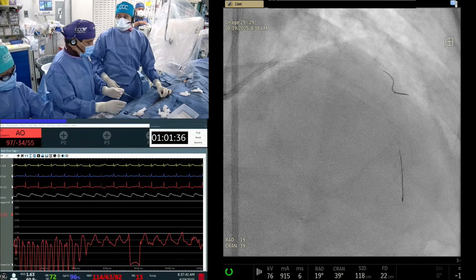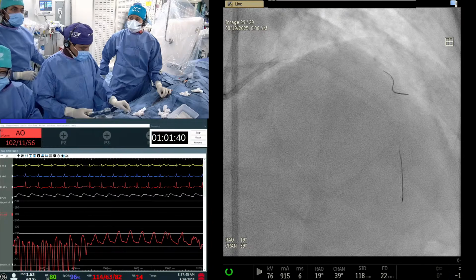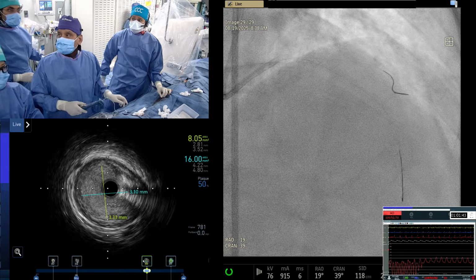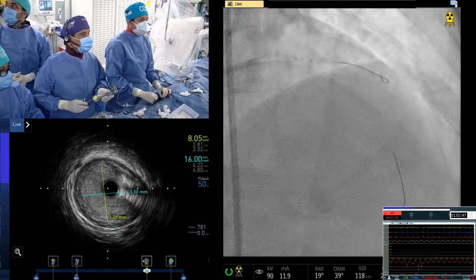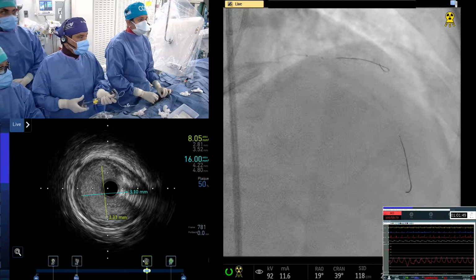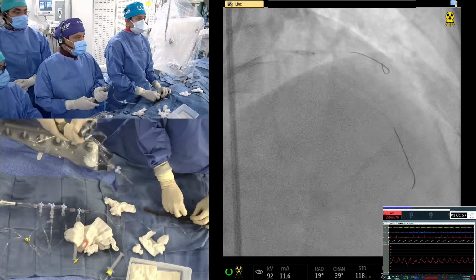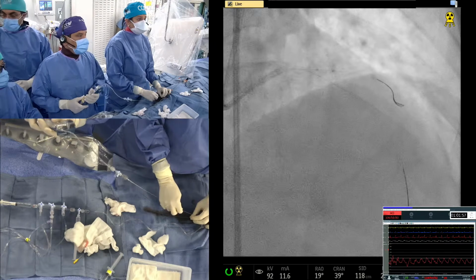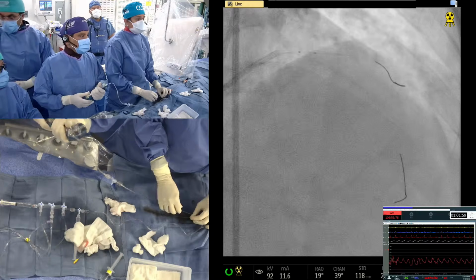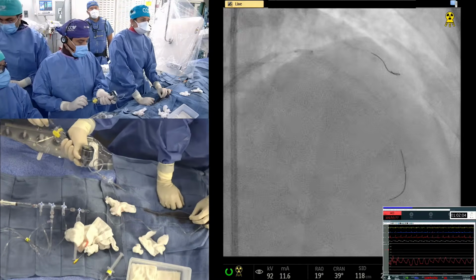So can we put the hemodynamics on the side and show the, go. Not IVUS, show the ceiling camera? Good. That's it. Let me just go up now. Okay, good. Okay, down. 16. Good. A little bit more. Yeah, good. Way too far. Good here. Yeah. And then you do ostium. Yeah, good.